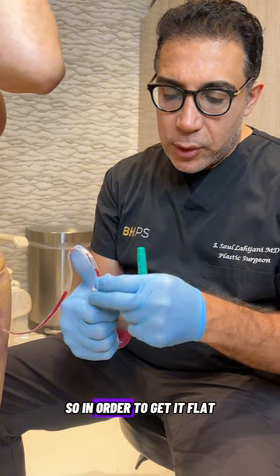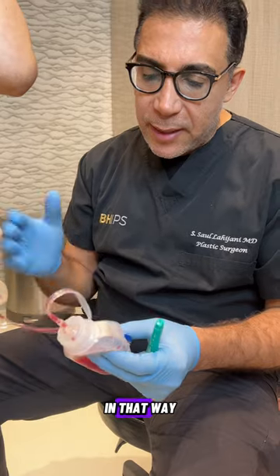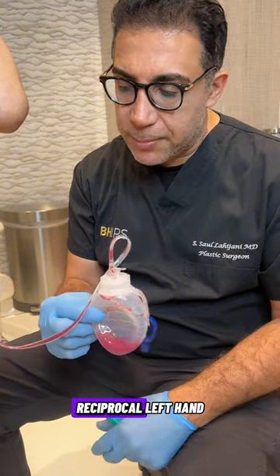So in order to get it flat, you push out the air and then cap it. In that way, it creates a suction and it allows the fluid to get suctioned into this receptacle.